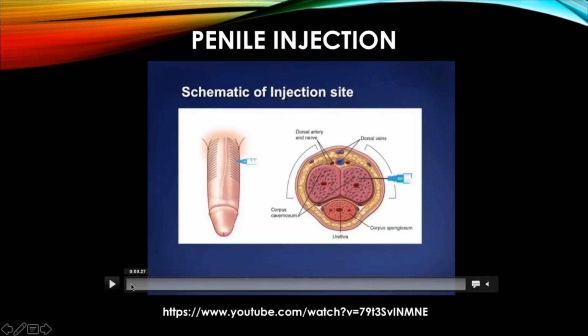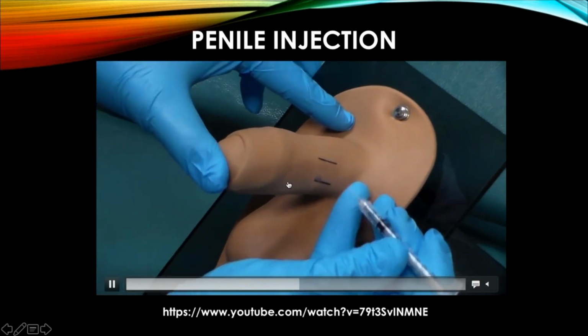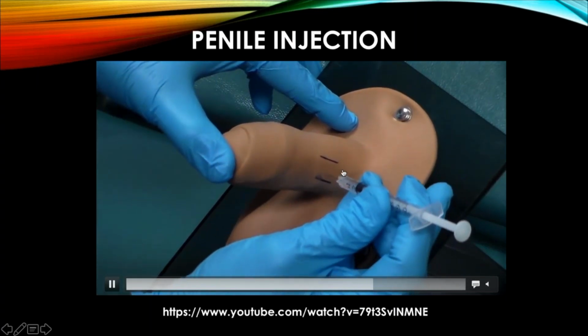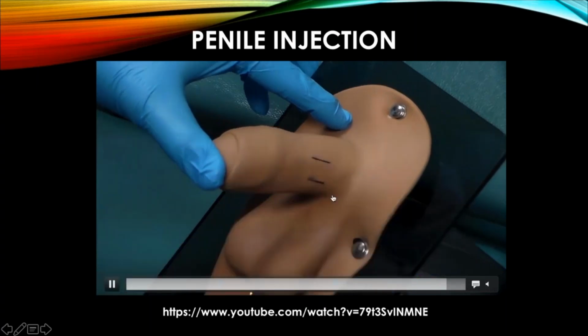So before I start this video, you're looking at a schematic of the injection site. And this is the area that we're talking about. So you're looking from about 1 o'clock to 3 o'clock, or 11 o'clock to 9 o'clock. And here is a dummy model of the penis. Those are the areas, and you want to stick the needle in quickly, pretty much all the way in, and inject.